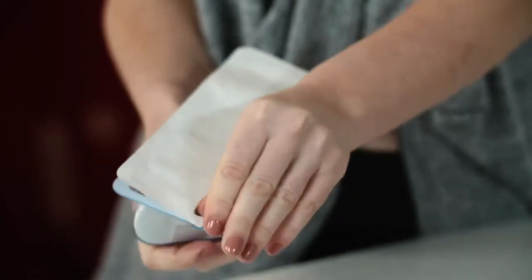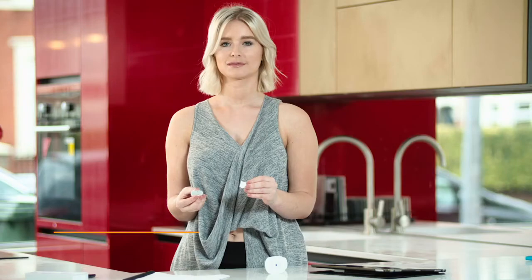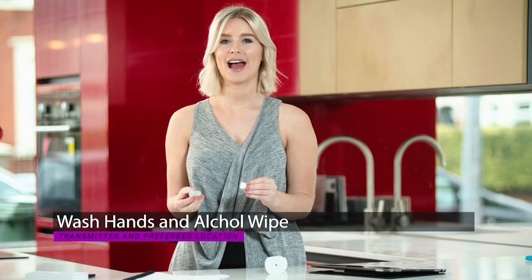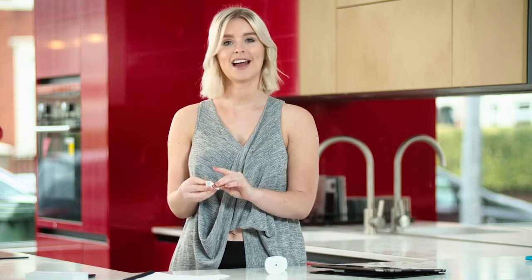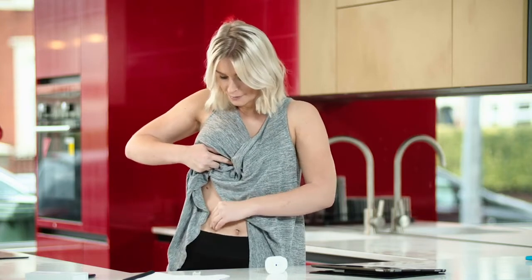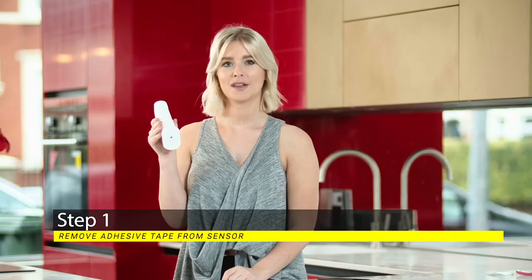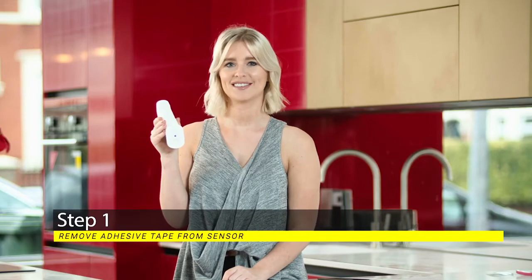Open the sensor packaging. The sensor is attached to the lower base of the applicator. Wash your hands and use an alcohol wipe on the transmitter and your preferred location. Wait a few seconds. Step one: remove the adhesive tape from the sensor.